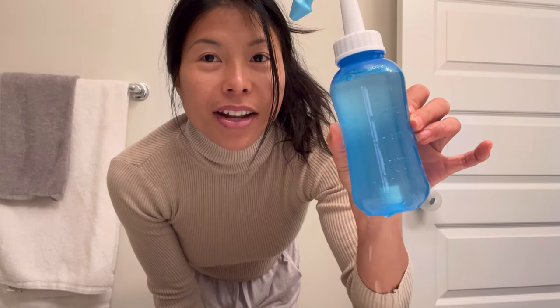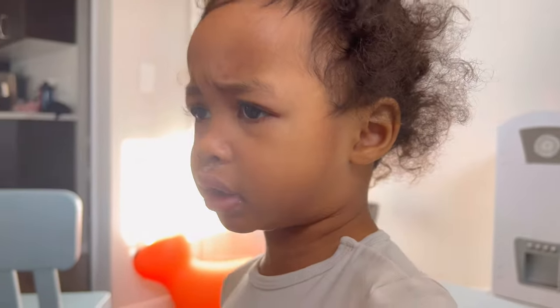Hi everyone, welcome to Mommy Clean It. In today's video I'm going to share with you how I clean my kids' nose with nasal flush. No! I don't want to!